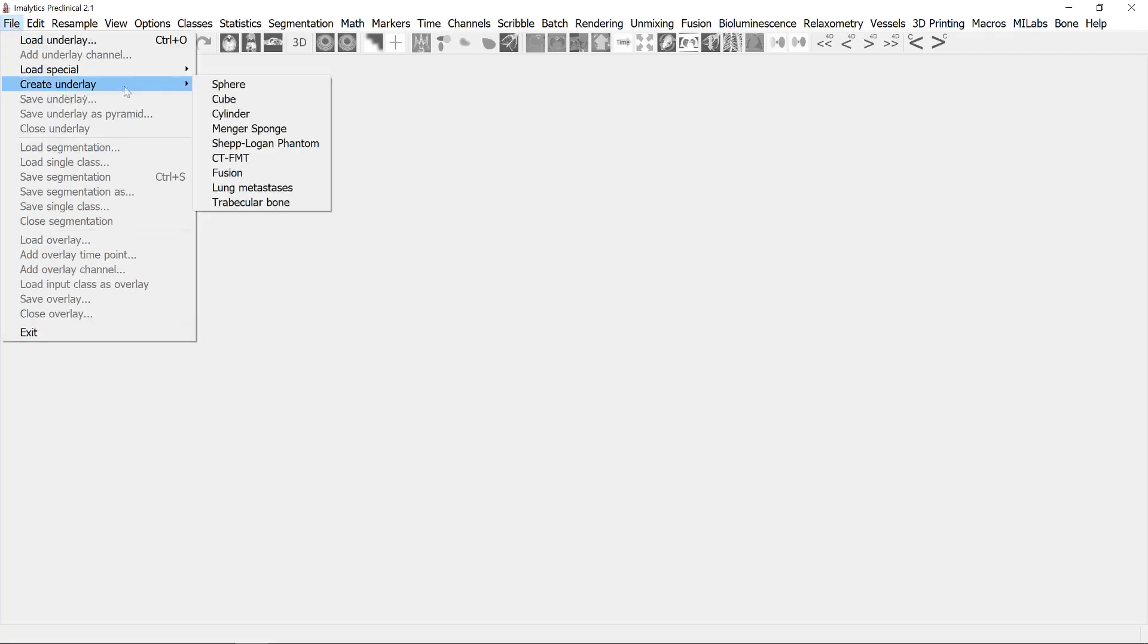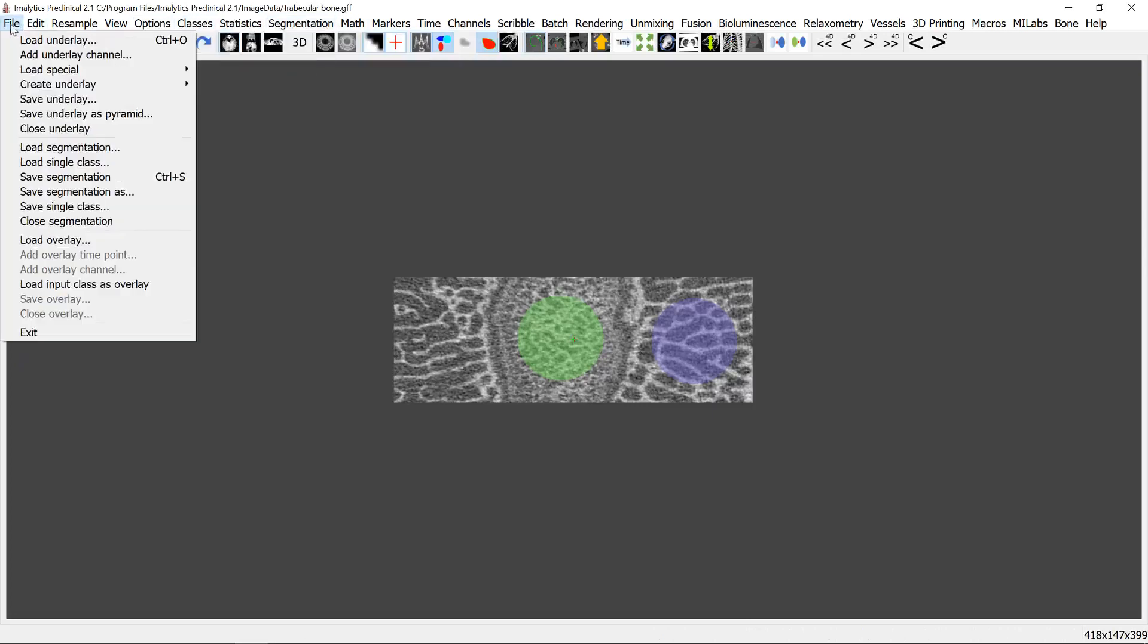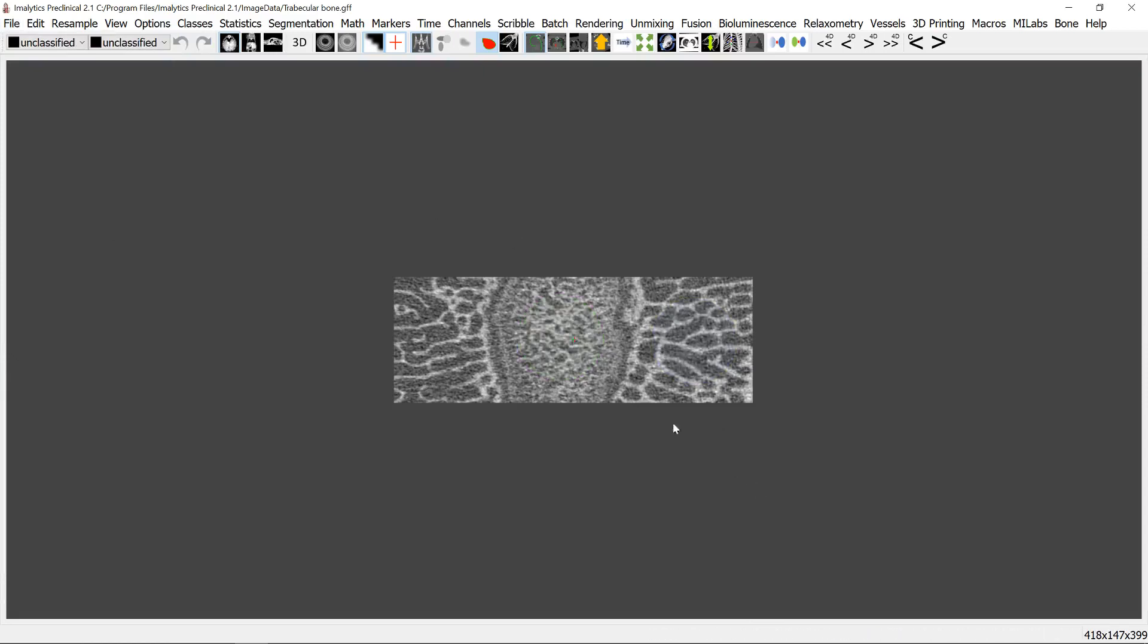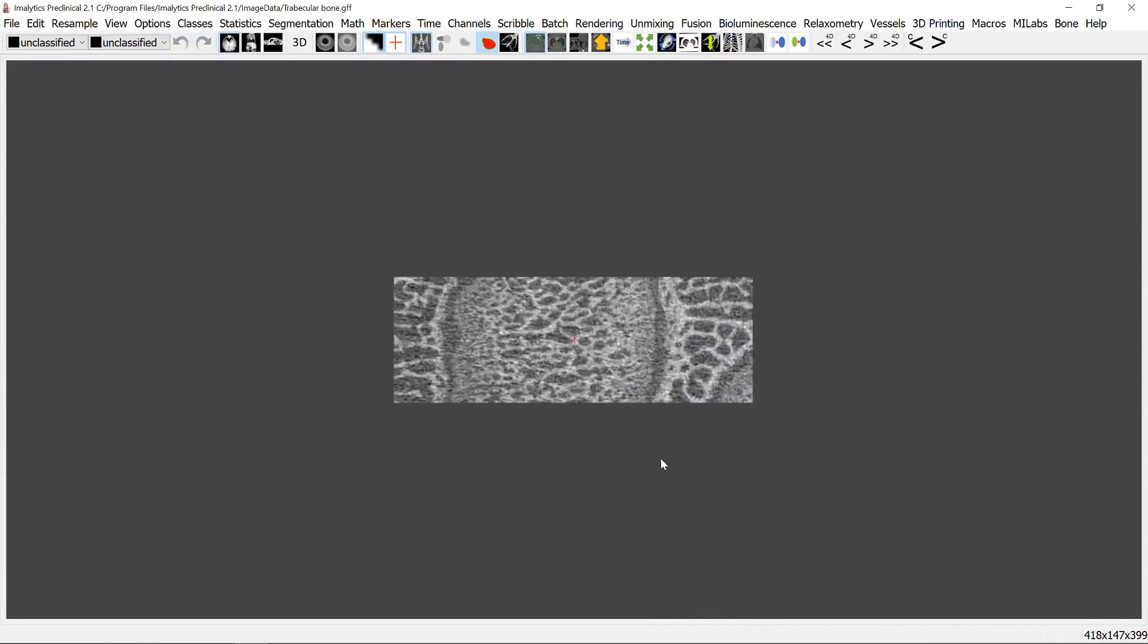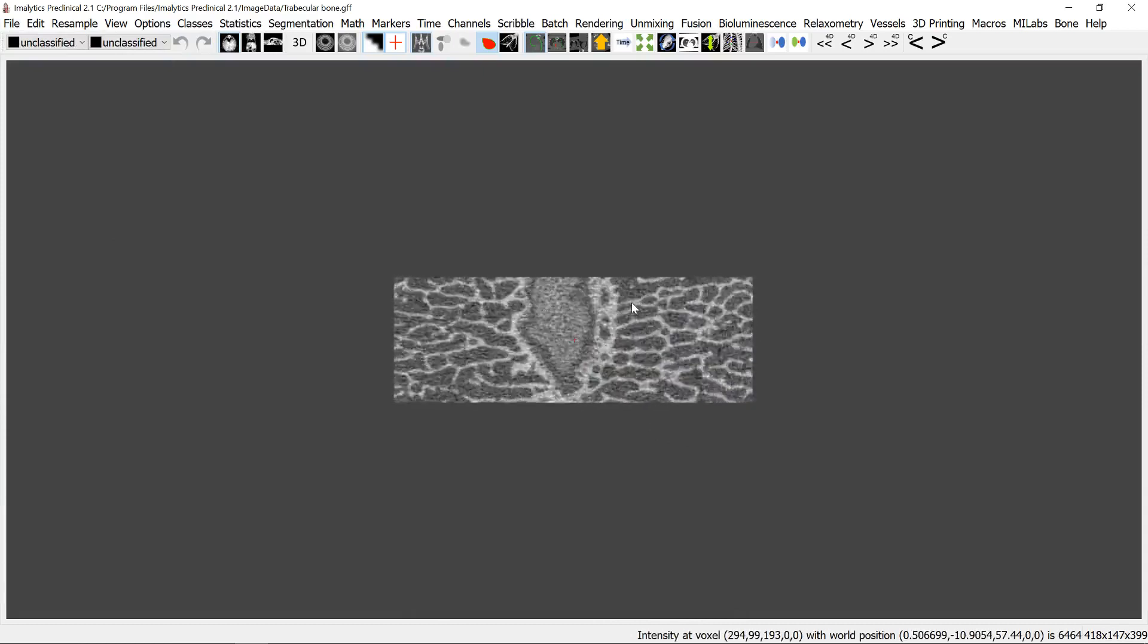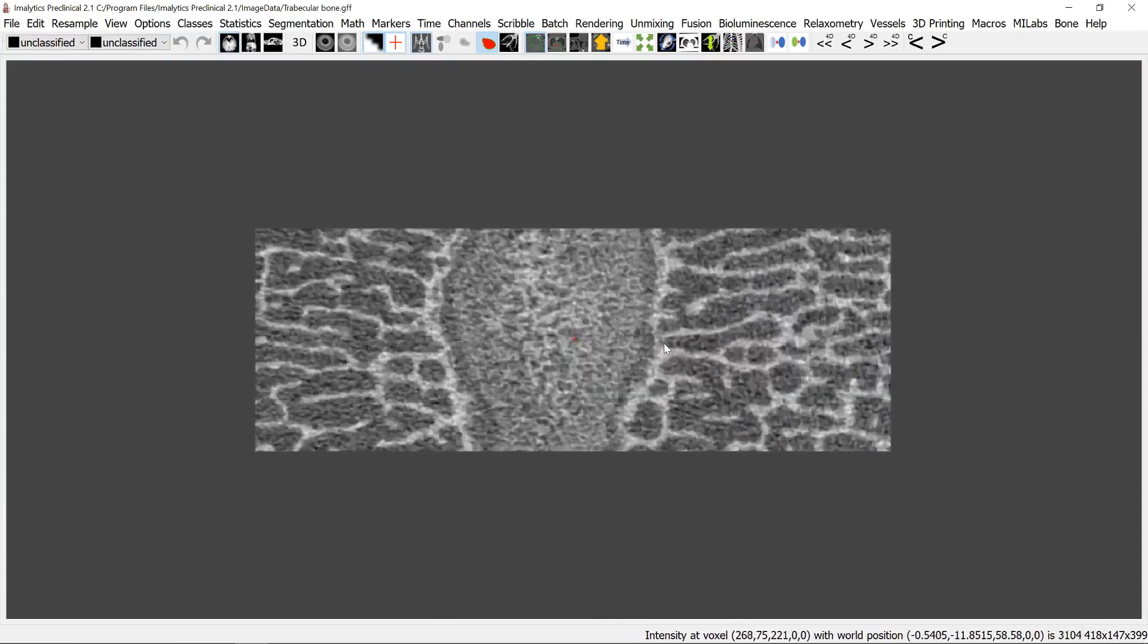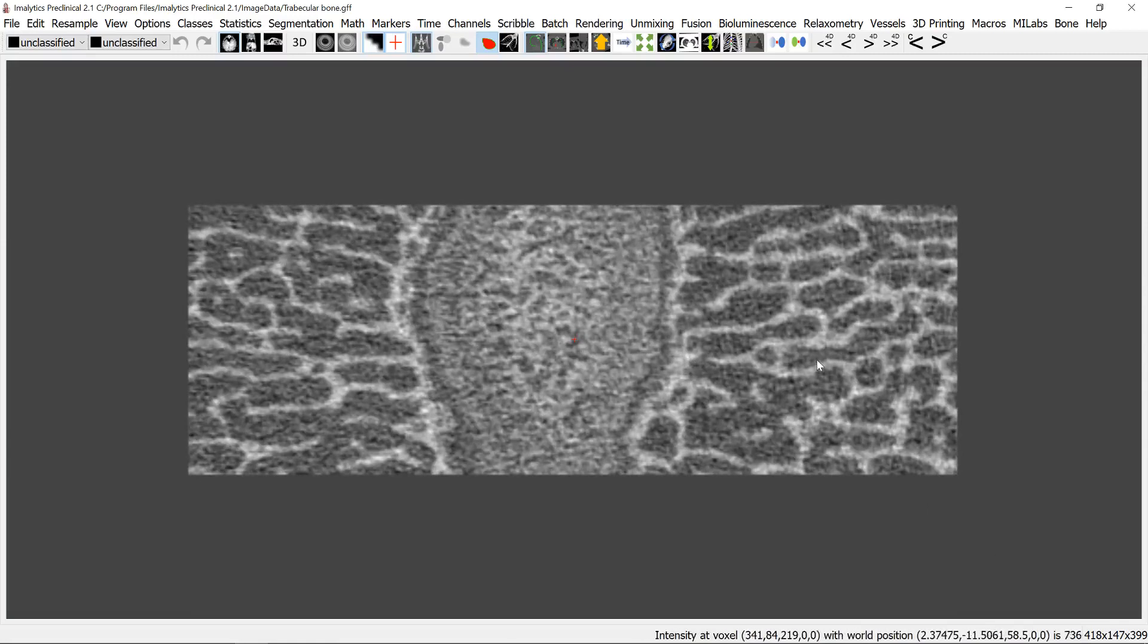So first please open the data set here and let's close the segmentation because we can create it ourselves. So what you see here is a part of a bone of a sheep knee actually and you can see the trabecular structures here and if we hover over them we can see the intensity here down there.